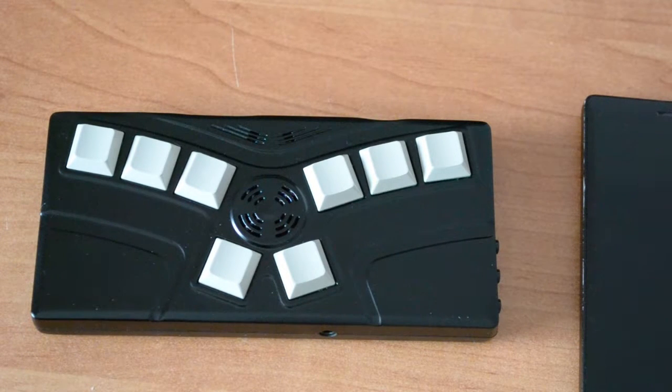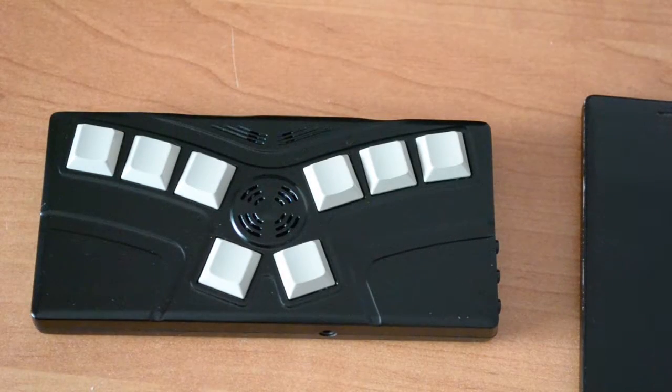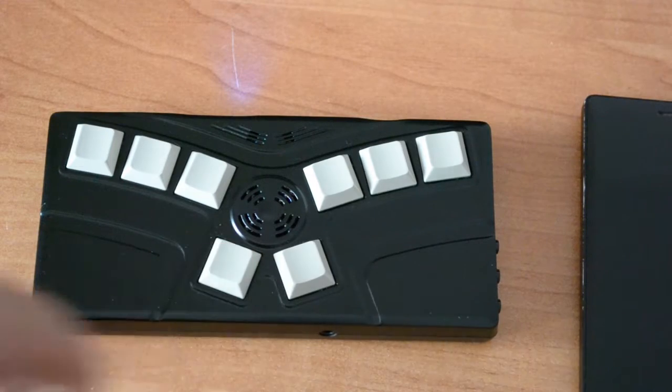Okay, we have already connected one device, my computer, and now I will show how to connect another device, a mobile phone. So we will switch the IBAI on. The IBAI is ready, and now we will go to the Bluetooth device list. My computer.